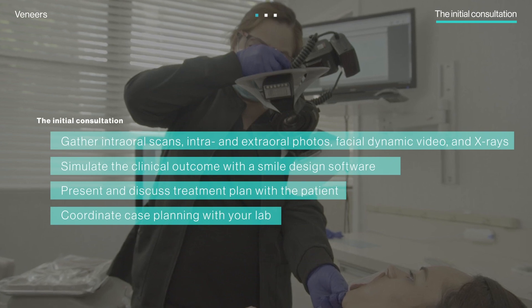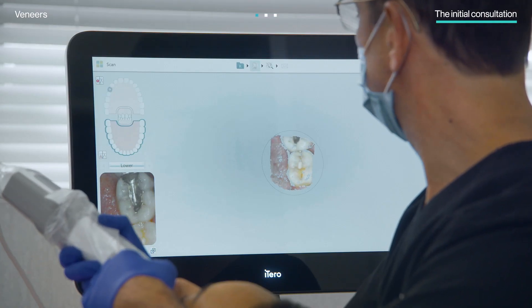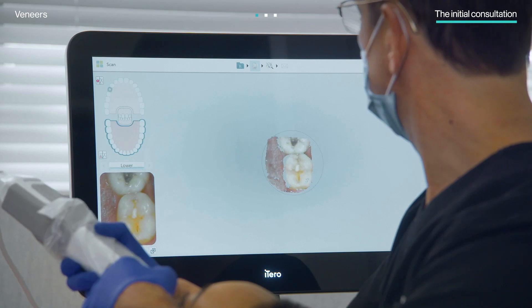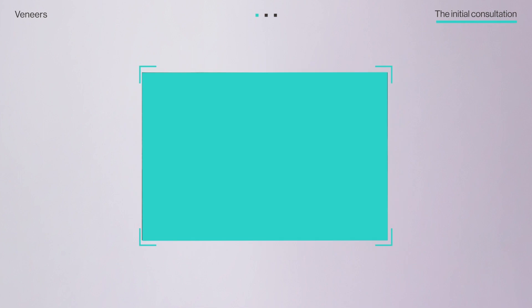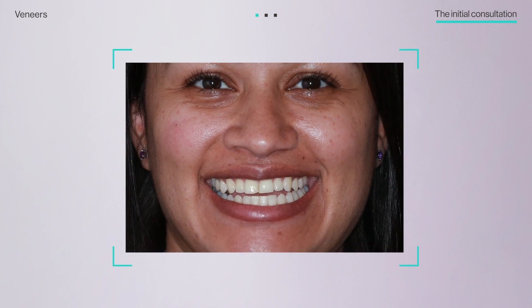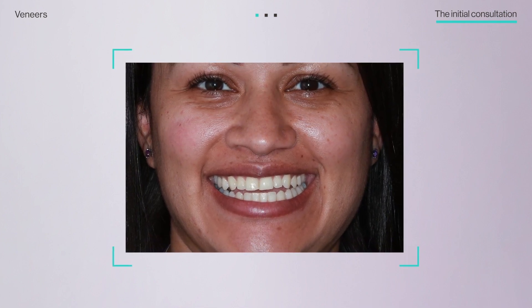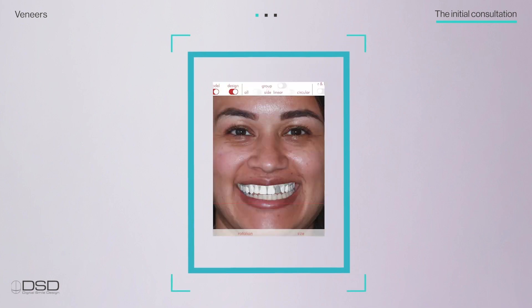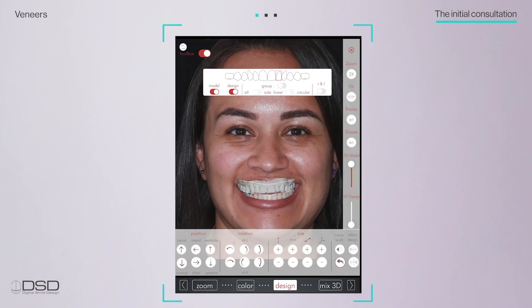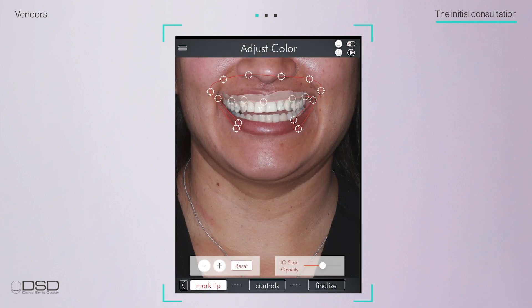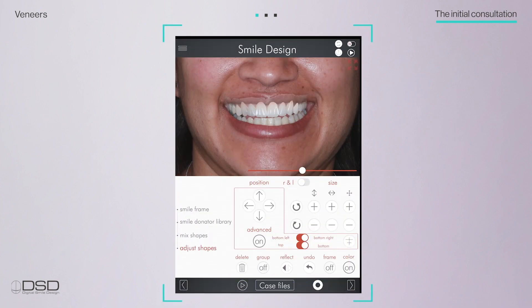At the initial consultation, Dr. Glassman captured high-definition intraoral scans with the intraoral scanner, in addition to other imagery like intra- and extraoral photos, X-rays, and facial dynamic video. The iTero scanner's open system allowed him to import them to the smile design tool of his choice to help simulate the clinical outcome of the veneers procedure.